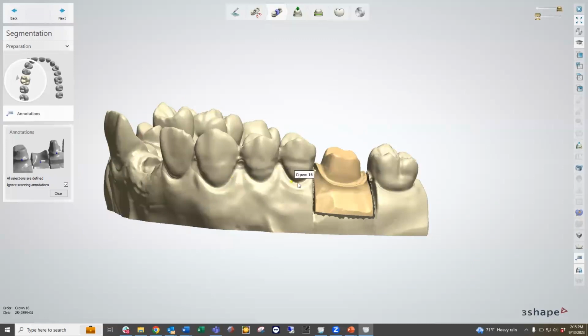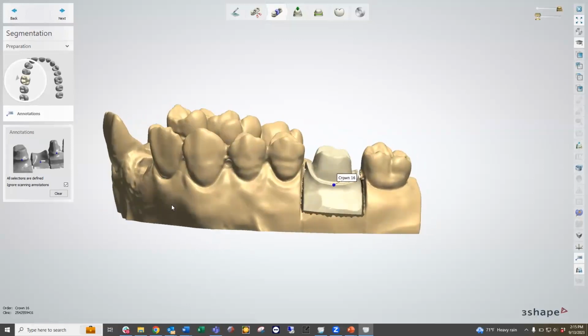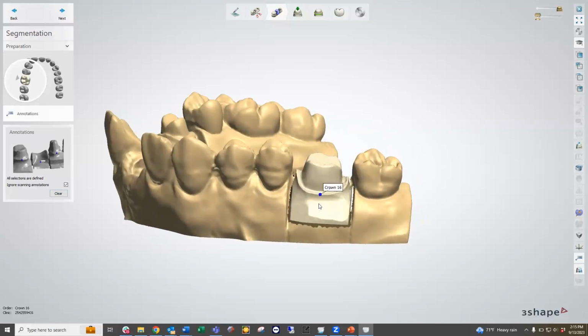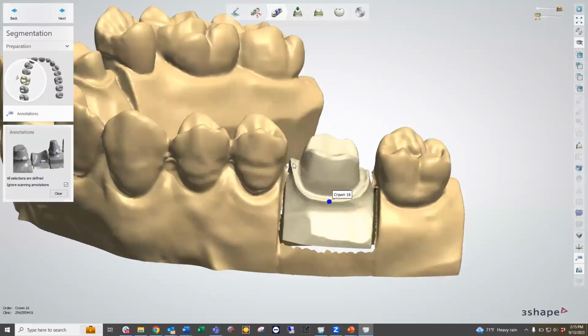So this one wasn't correct, so I can either click and drag it over to where it needs to be. And now you can see that it highlights the die correctly as we see here. Or I can clear all scanning annotations and add my own annotation. Now we do want the annotation, or this little dot, to be on the buccal around the midline of our unit, because that's going to help differentiate the process going forward when it goes to select or input our idealized crown design. It uses that as a reference point to determine which side is going to be the buccal. So I always put this on the buccal margin. Some people put it on the buccal in the midpoint of the crown. I always like to put it right on the margin. That's just typically going to help us gather more information relative to the margin going forward and be a little bit easier for when we draw those margin lines.